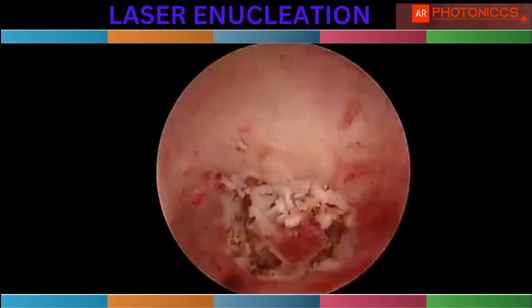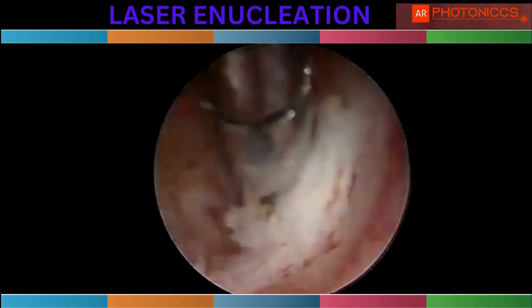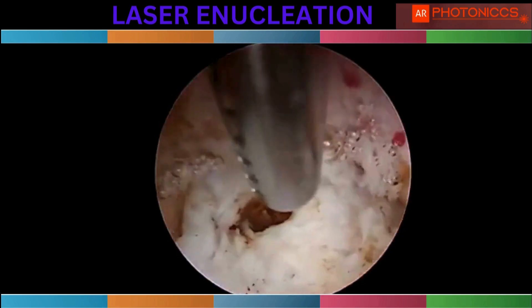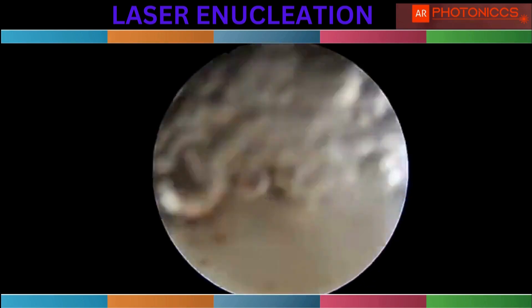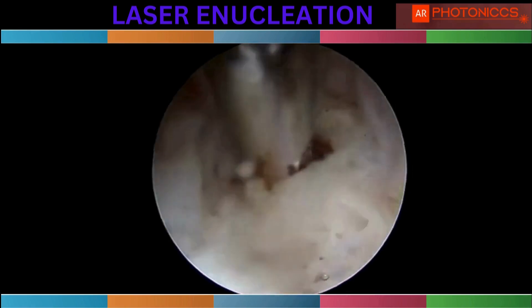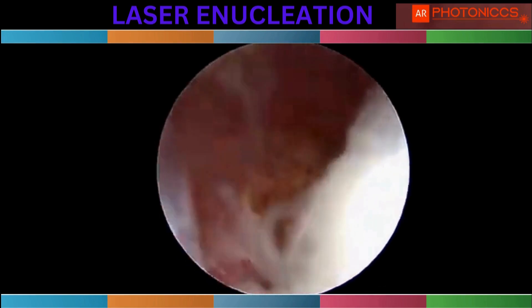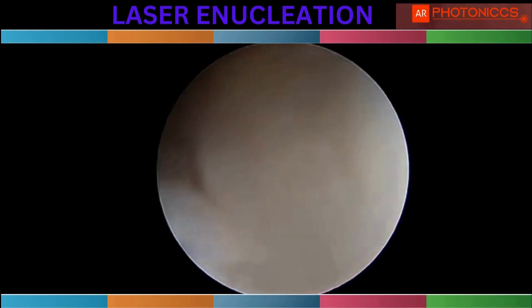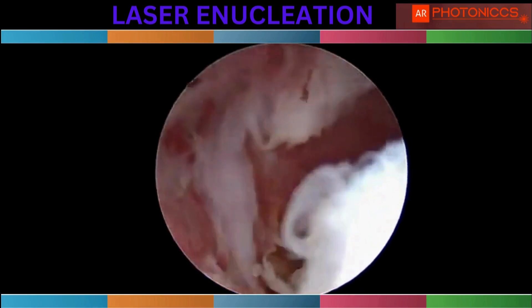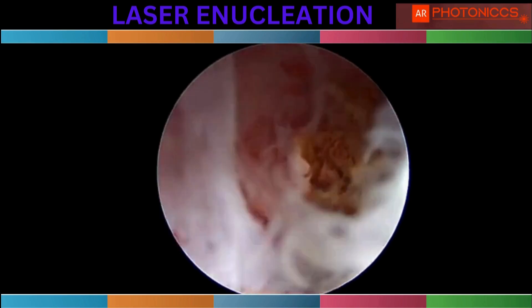This is the beauty of this technique for infertility cases — when you do a resectoscope there is a lot of endometrial damage. The technique used here is crown cutting: crown cutting the fibroid from the endometrium, then we use the forceps. You see how we use the forceps to create a plane of cleavage, just expanding it. The instrument movement is just rotation and twisting, separating from the pseudo capsule. You should know the anatomy of the pseudo capsule and always separate the fibroid between the pseudo capsule. We use the laser to cut the fibers, we use scissors to cut the fibers, we use forceps to separate.